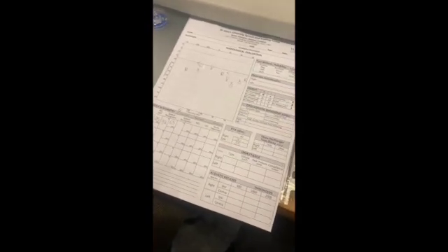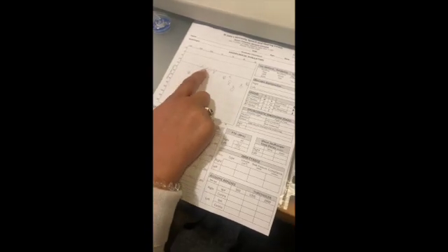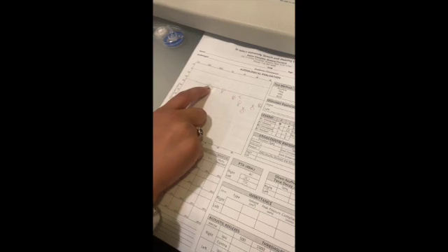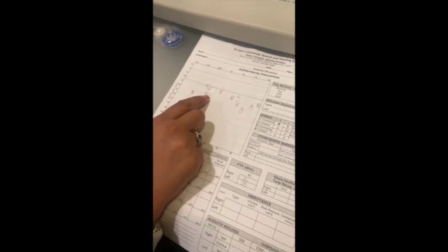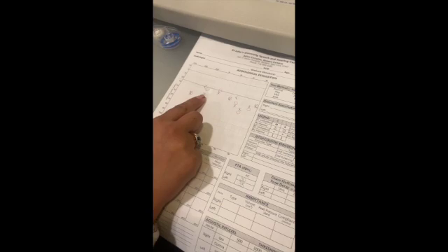So bone conduction masking is done when there is a 15 dB or more air-bone gap, which means there's a gap between your bone conduction thresholds and your air conduction thresholds. In this example, at 500 Hertz, there is a bone conduction of 25 dB, and your left air conduction score is 40 dB, which shows a 15 dB gap, so we have to mask for bone on the left side.